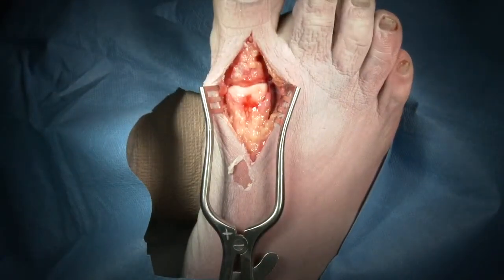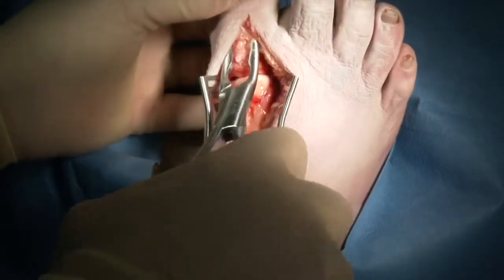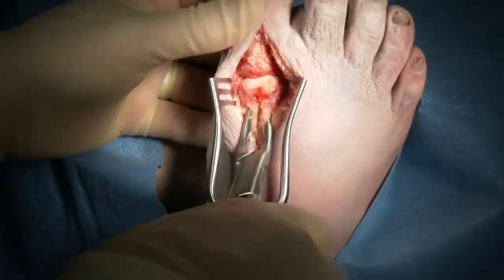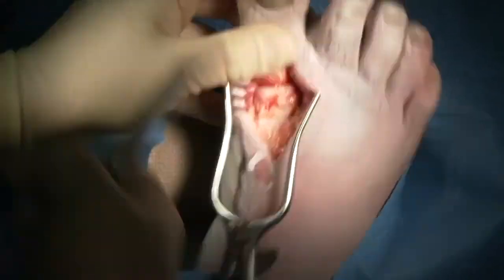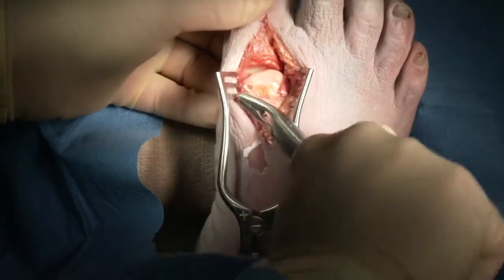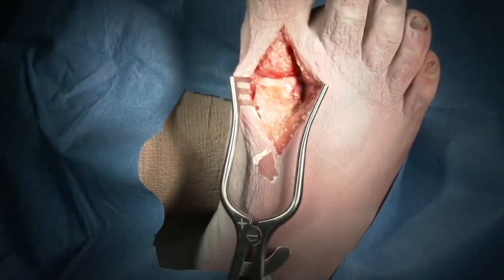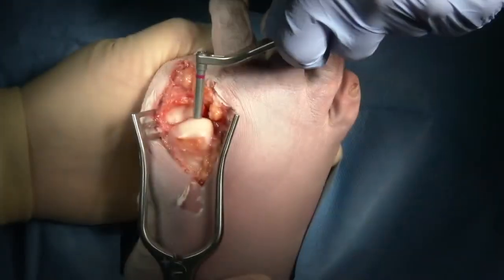Once the soft tissues are adequately released, you can clean off any osteophytes that may be present as well as any synovium that needs to be removed in order to get better exposure to the bone itself, and this can be done with a rongeur. It's helpful to remove some of the dorsal osteophytes and flatten that dorsal cortex of the metatarsal to show how distal the joint surfaces go for your preparation. If there's scarring on the plantar aspect of the joint, an osteotome or a McGlamrey retractor can be utilized to help gain better plantar flexion.